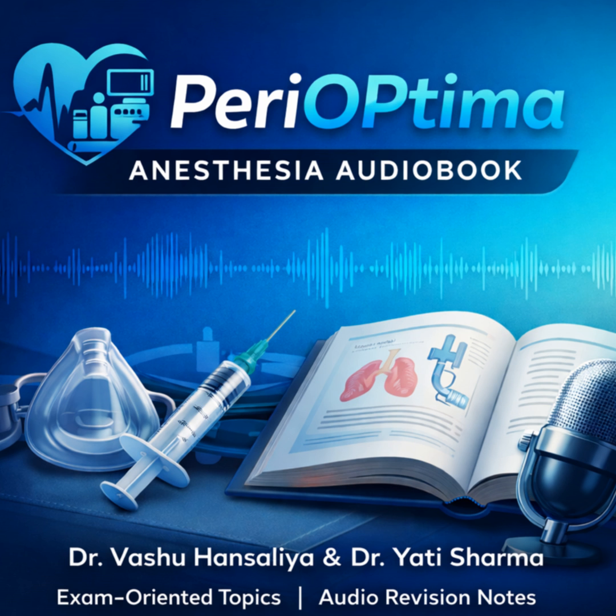And the final safety-related trap we keep coming back to. Trap, ignoring the need for cuff pressure monitoring. The safe answer is that you must highlight the importance of using manometry to prevent pressure-related complications, like sore throat and nerve injury, and you cite the therapeutic range of 40-60 cm H2O. This demonstrates that you prioritize patient safety beyond just a successful insertion.